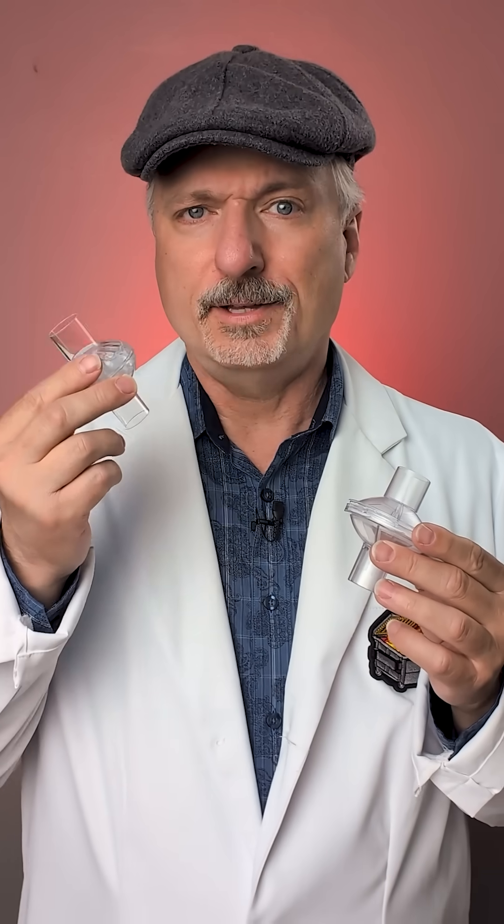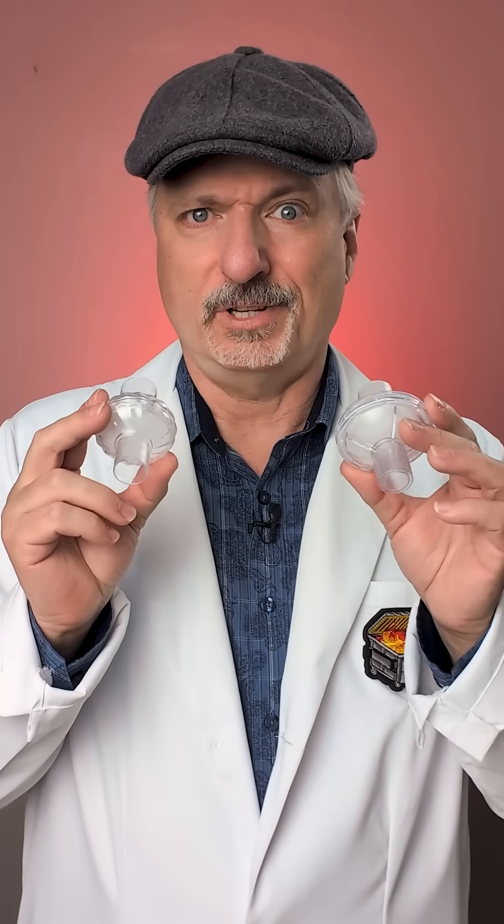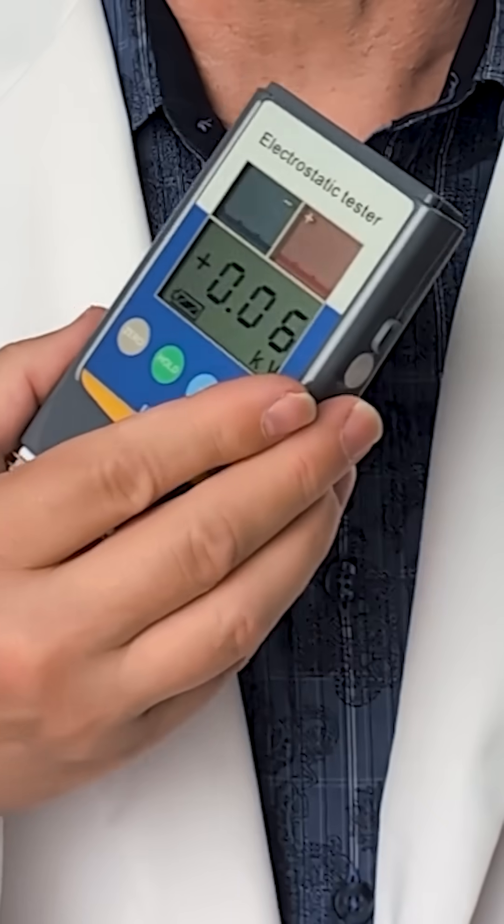When I tested these inline CPAP filters in the last video, this model did really poorly and I wondered why, because they look really similar to these other filters. Well, today we may solve that mystery with the help of this — a static electric charge meter.